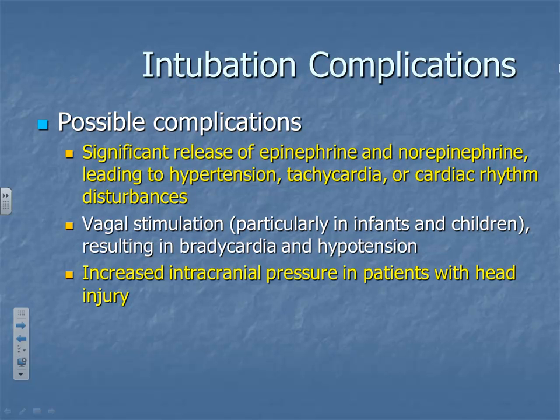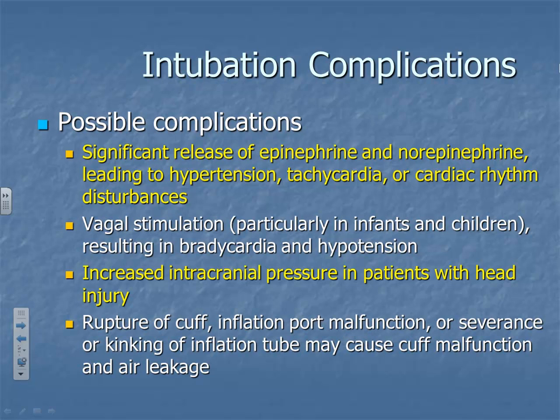Okay, so when you go to intubate a patient with a head injury, you got to recognize that you may increase their intracranial pressure. It's not good. Other problems, if you have equipment problems, you know, the balloon malfunctions or something.